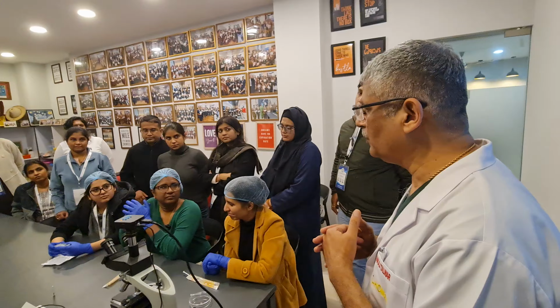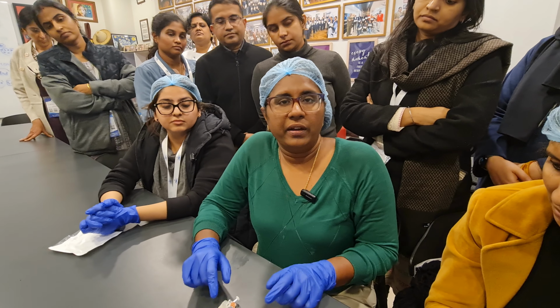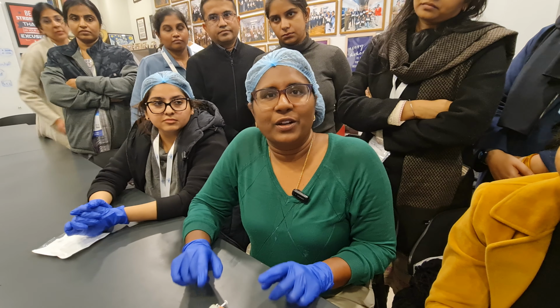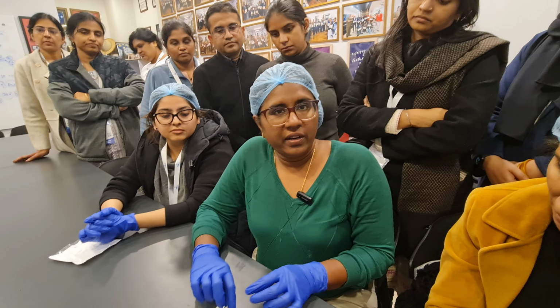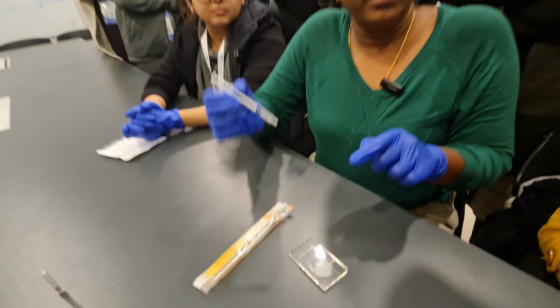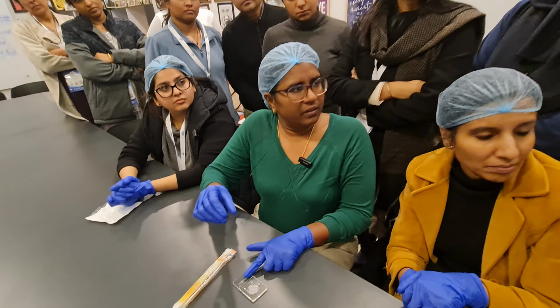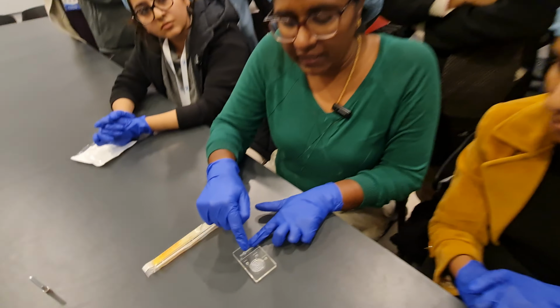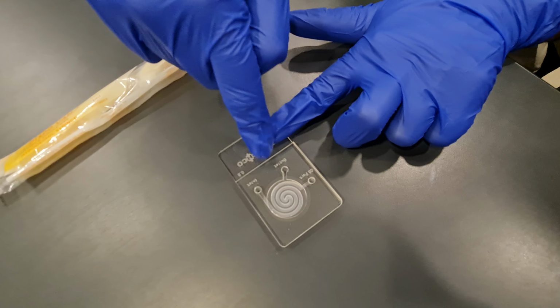So now we'll go to you. Dr. Indumati, I am part of course 1, batch 136 under Dr. Talwar sir. So today we are demonstrating microfluidics. I am going to inject the raw semen sample in the inlet portion of the microfluidics semen sorter.